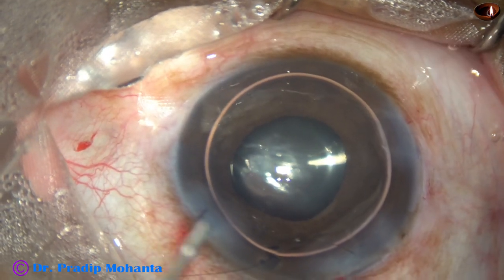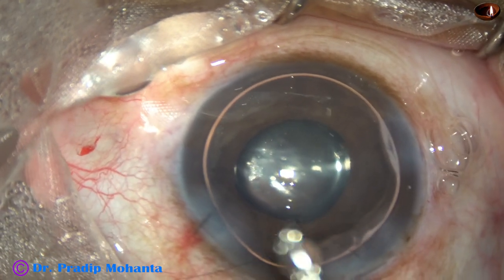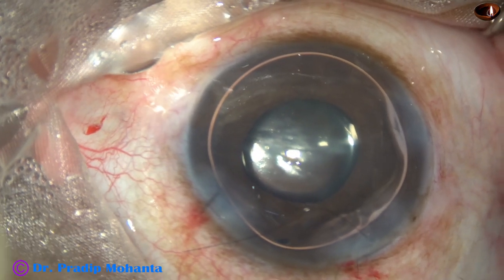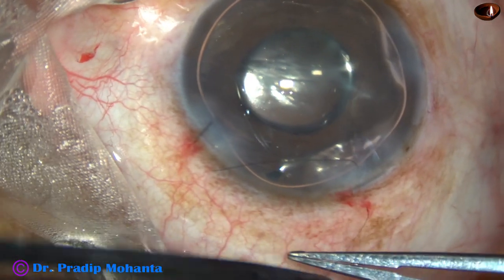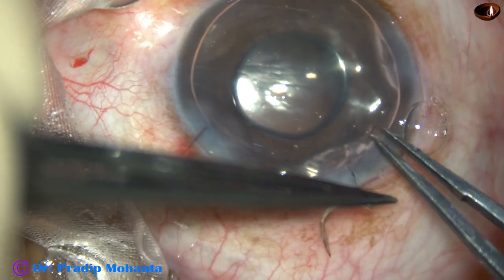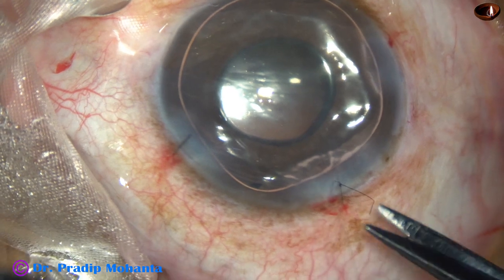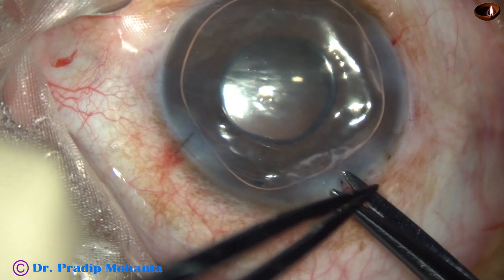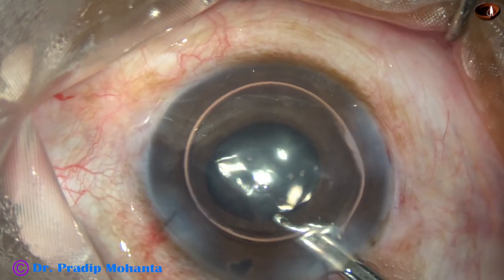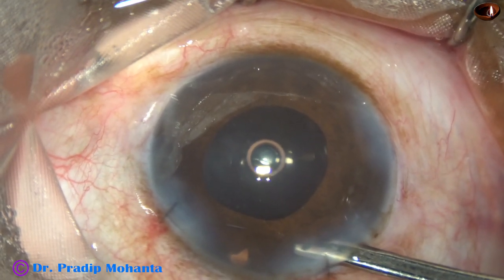We inject air, and now this is moxifloxacin. The main wound is now closed by placing the knot. This suture should just appose the edges of the wound — it should not be very tight — and the knot is buried in the sclera or cornea. This is the final lavage of the anterior chamber. The anterior chamber is formed very nicely and the case is concluded.